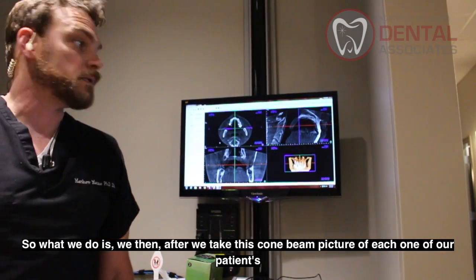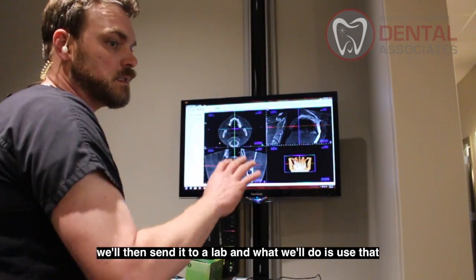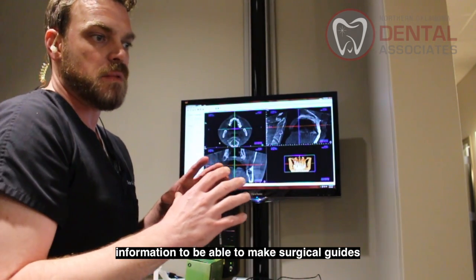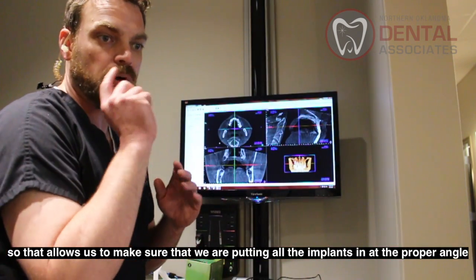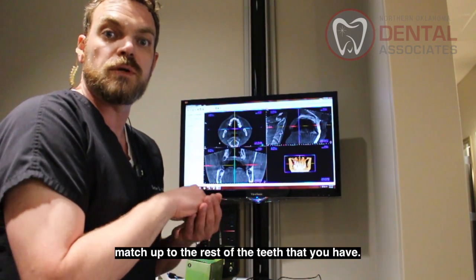So after we take this cone beam picture of each one of our patients, we'll send it to a lab, and we'll use that information to make surgical guides for implant placement. That allows us to make sure that we're putting all the implants in at the proper angle, so that whenever we put the crowns on those teeth, they're going to match up to the rest of the teeth that you have.